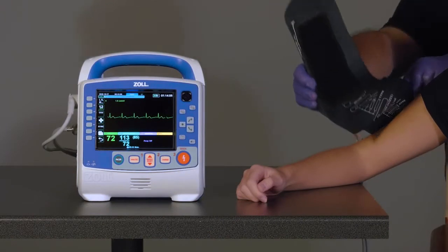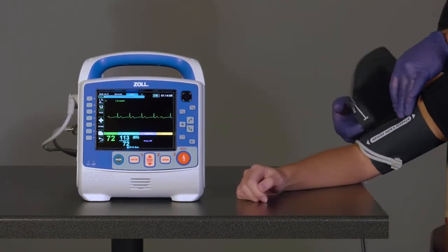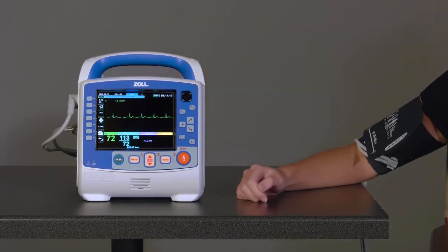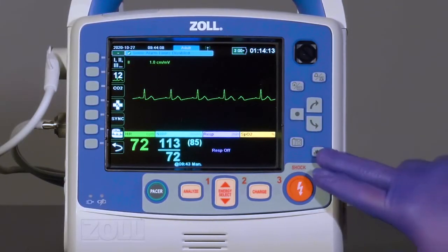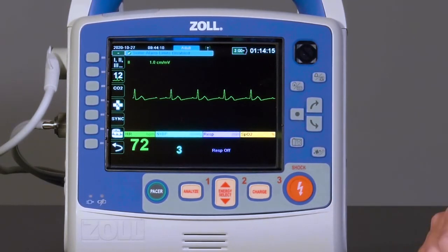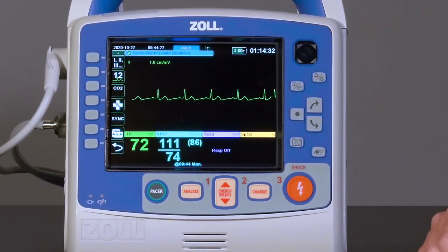To obtain a reading, confirm the inflation hose is properly attached to the X-Series and to the cuff. Apply the deflated cuff to the patient and press the NIBP button on the front of the X-Series. The reading will be displayed in the NIBP window on the X-Series screen. The default display will show systolic pressure over diastolic pressure with the mean arterial pressure, or MAP, in parentheses.